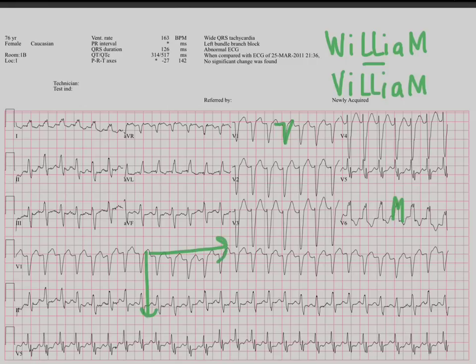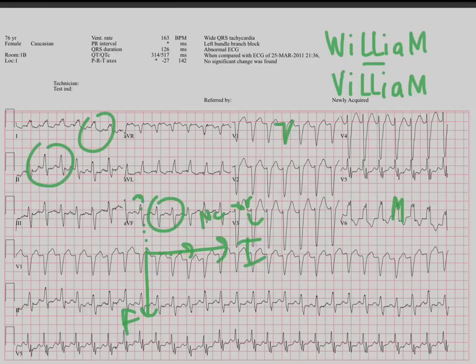So F is this way. 1 is this way. F is going mostly down, right? So it's mostly negative F. And 1 is mostly positive. So it's in this quadrant over here. So it's either normal or left. And, well, 2 is mostly positive. So it's normal, but it's in this area here. It's that portion of the left side of the normal. Anyway, so this is a left bundle branch. And that's exactly what the EKG read it as.